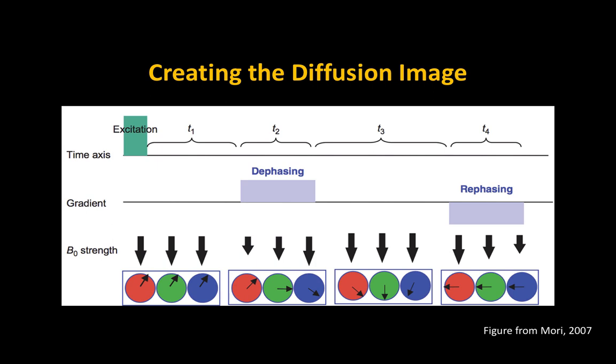With magnetic resonance, we're primarily interested in hydrogen because that composes a lot of the protons in your body. And they have this intrinsic property called spin. So think of them as tops, and if we're looking from the top down, you can see them spinning around a certain axis. Now, with our magnet, we can elicit these things called excitation or radio frequency pulses to turn the direction of the spins onto a perpendicular plane, perpendicular to the main magnetic field, which is very strong and it's always on.